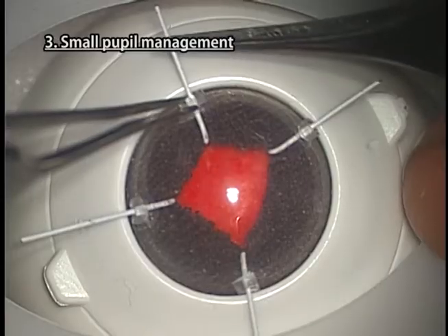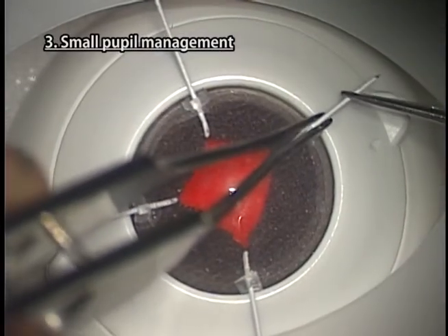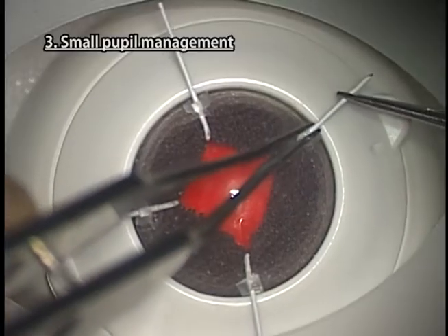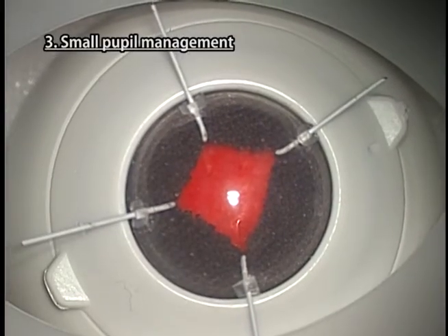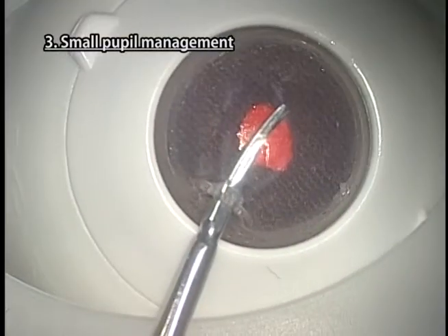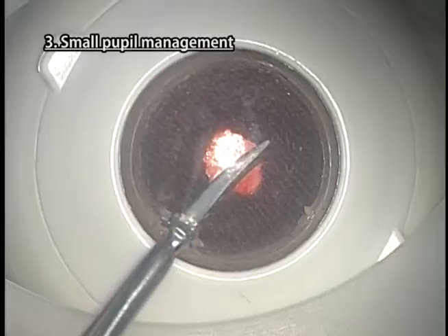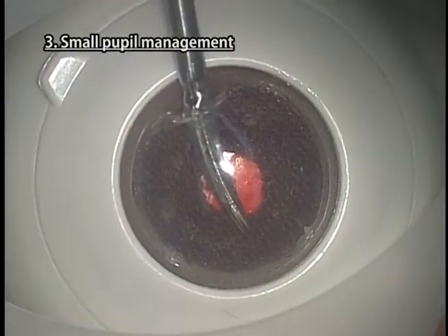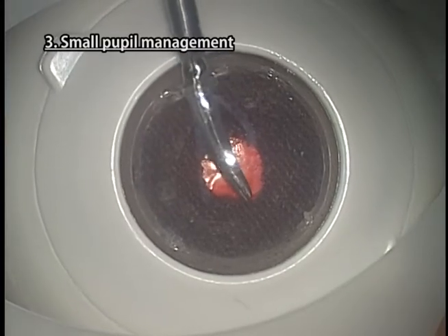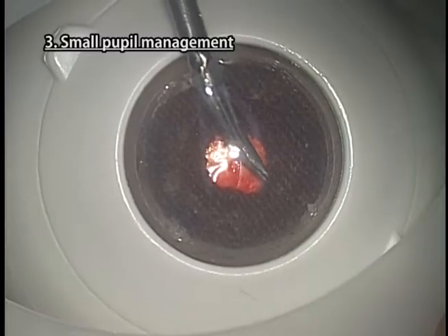Pupil dilation using a Malyugin ring cannot be performed. Sphincterotomy can be performed, but the pupil will not enlarge. If you actually make incisions, you will not be able to use the model again. For practice purposes, it is advisable to make pseudo-incisions above the pupil.